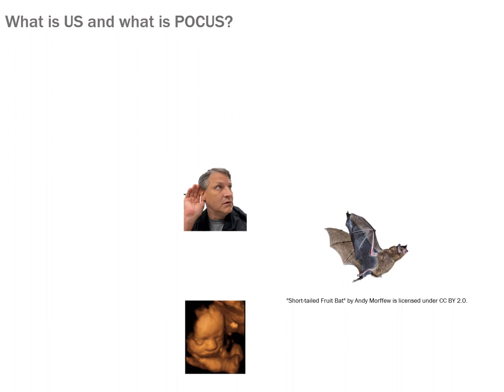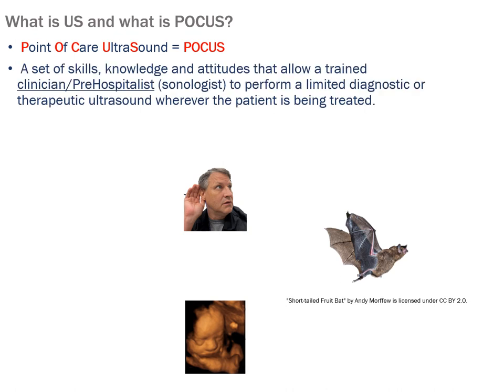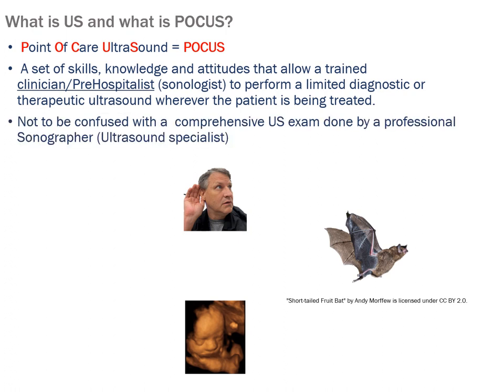So what is POCUS? POCUS stands for Point of Care Ultrasound. It's also known as bedside ultrasound. However, point of care could be in the field, which is why POCUS is more appropriate for the pre-hospital provider. And really, it's a set of skills, knowledge, and attitudes that we're trying to get a pre-hospitalist savvy with and skilled with in order to perform limited diagnostic and therapeutic ultrasound wherever the patient's being treated.